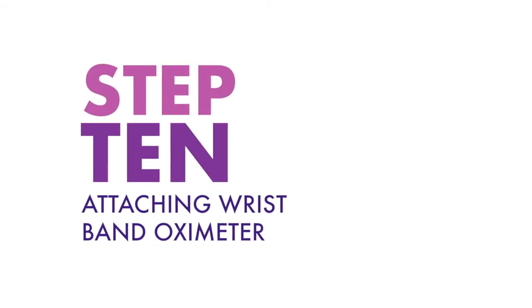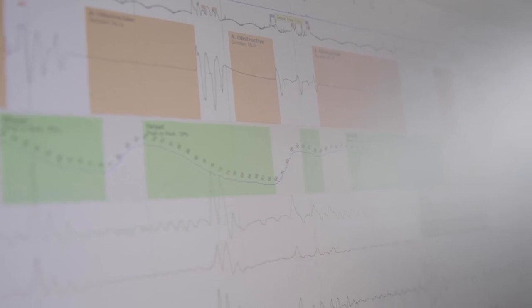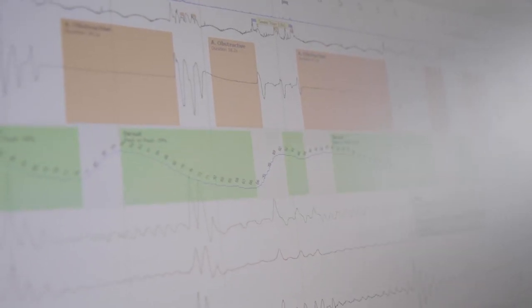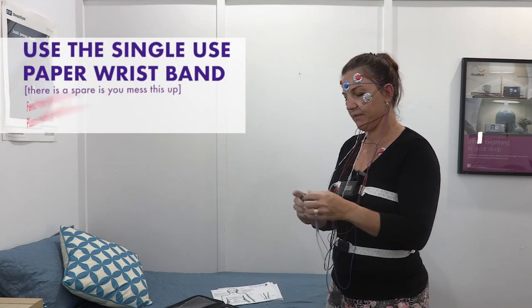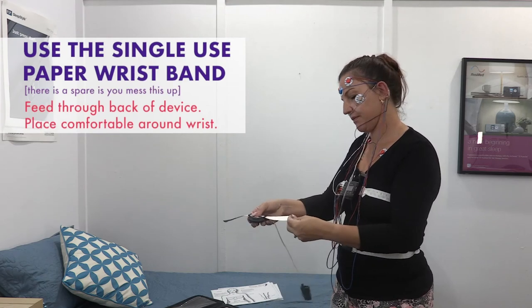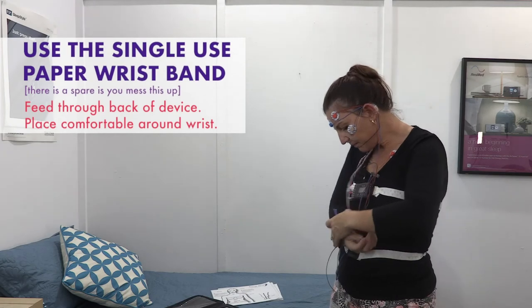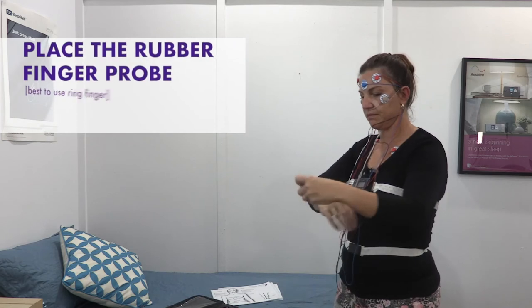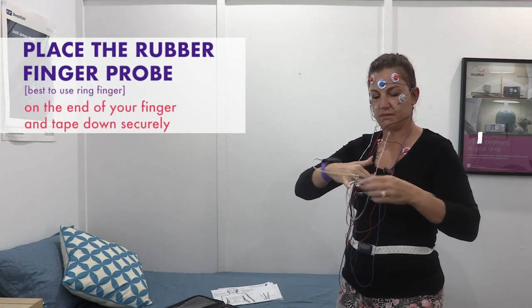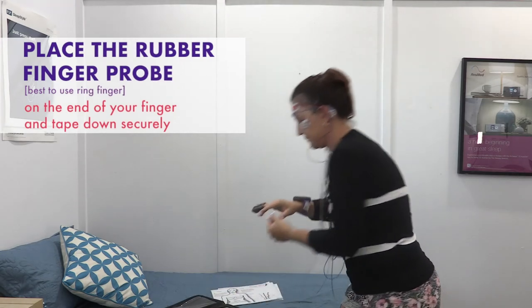Step ten: attaching the wristband oximeter. This wrist device and finger probe will record your heart rate and oxygen levels. This device must be worn the whole night for a valid sleep study. It's best to put this on your non-dominant hand. Use the single-use paper wristband and feed through the back of the device and place comfortably around your wrist, making sure it's not too tight or loose. If you mess this up, there will be a spare to try again. Place the rubber finger probe on the end of your finger — it's best to use your ring finger, but you can use any finger you like — and tape down securely.